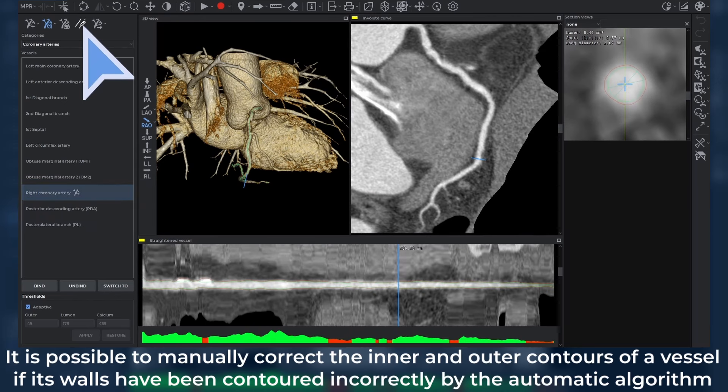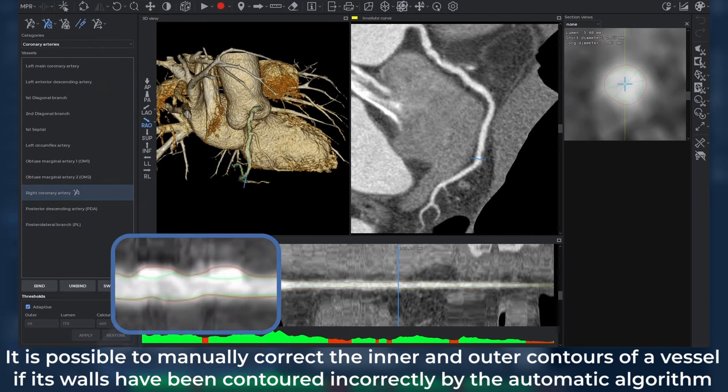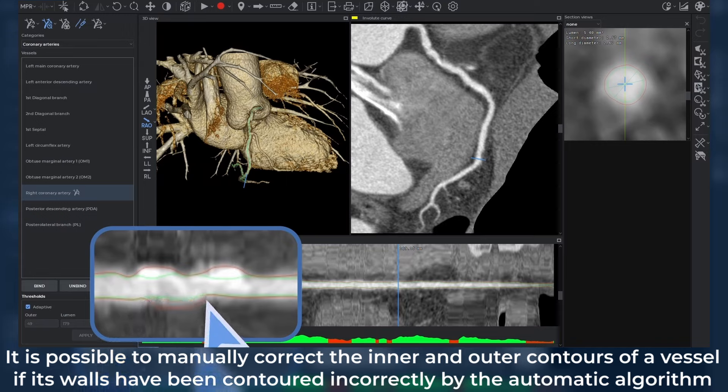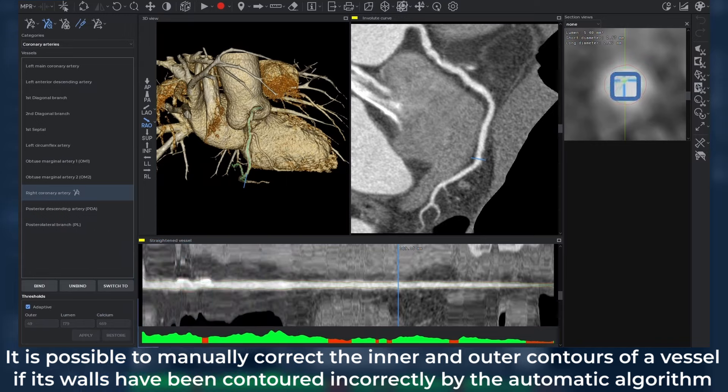It is possible to manually correct the inner and outer contours of a vessel if its walls have been contoured incorrectly by the automatic algorithm.